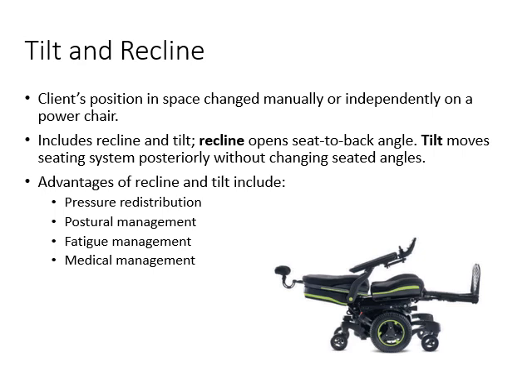Tilting is not the same as reclining. Tilting is when the entire seat changes its angle, and reclining is when the back opens up, so the angle between the seat and the back opens. In the picture, we see a reclining seat. Often tilt and recline go together.